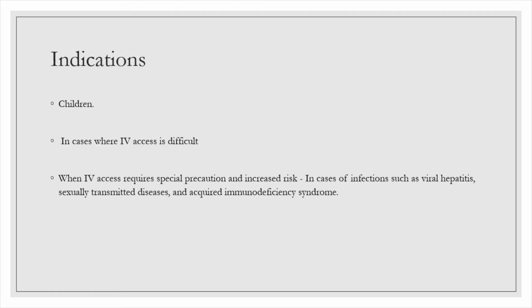So where is it indicated? It is indicated in children and in cases where IV access is difficult. It can also be used where IV access requires special precaution and increases the risk, such as in cases of infections like AIDS and STDs and viral hepatitis.